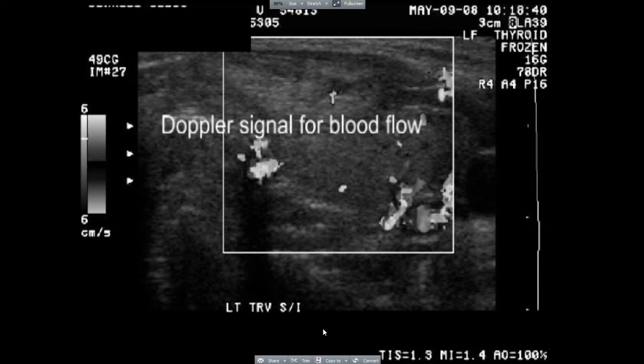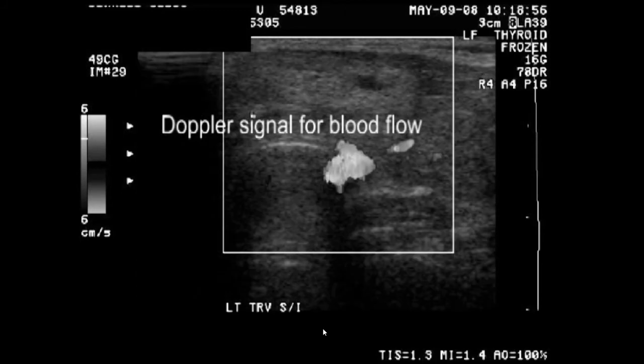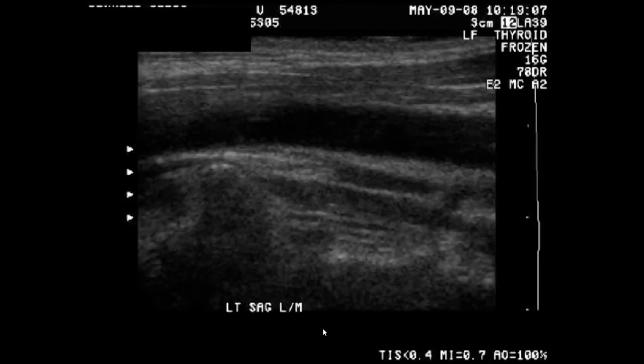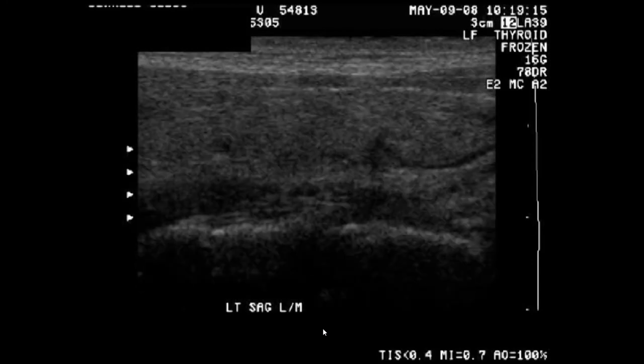Here the ultrasonographer has turned on her Doppler probe to measure blood flow. If these were actually color images, we could identify the vessels. Again, this vessel is the internal jugular. We know this from the anatomy, but need compression to verify.